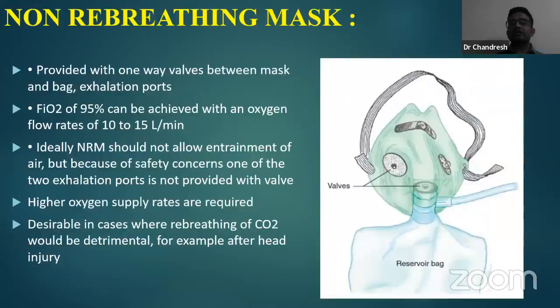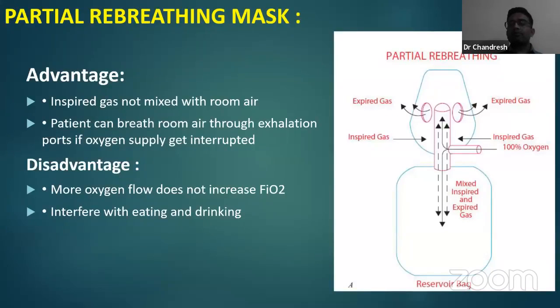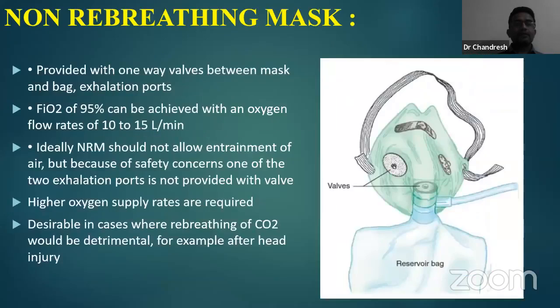So here you should understand this opening on the side for the expired gas is one way, a safety mechanism. Because there is no unidirectional valve here, even if by chance the oxygen supply is disconnected, the patient can breathe through these holes. Next, if you think about the non-rebreathing mask, the design is a little bit different.